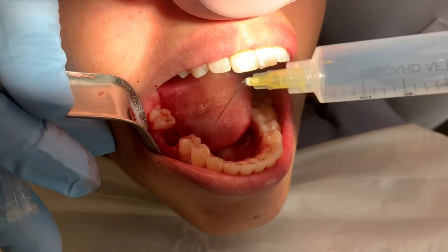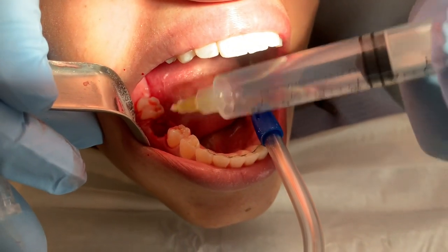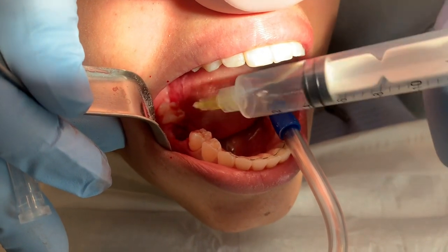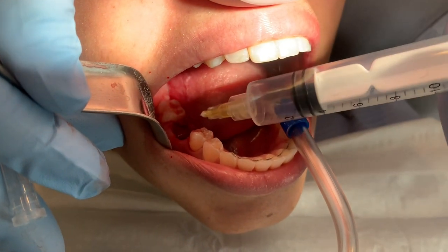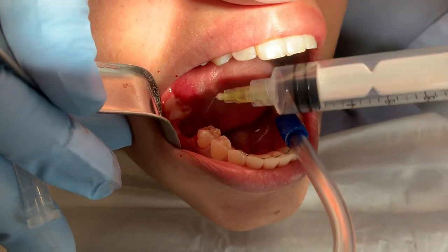This is the ozone and oxygen gas. We more or less will just bubble this down into the extraction site. You can see bubbles forming. The other thing you see here too, there's not a lot of blood, but there's a little bit that lets us know that this bone is alive and healthy.